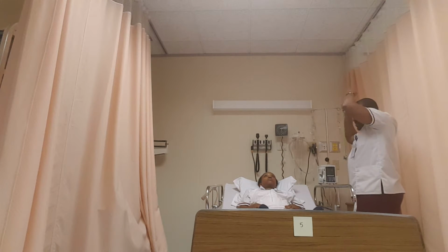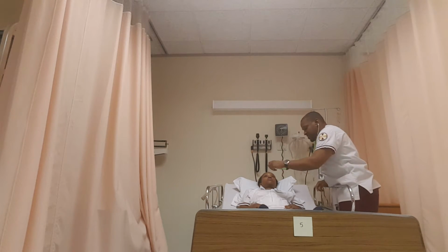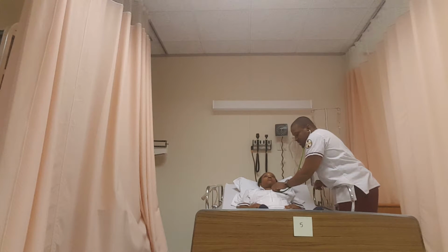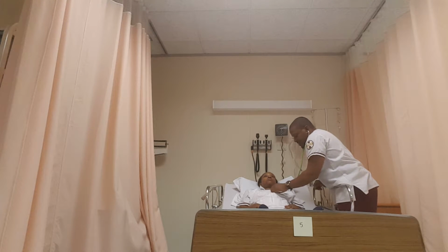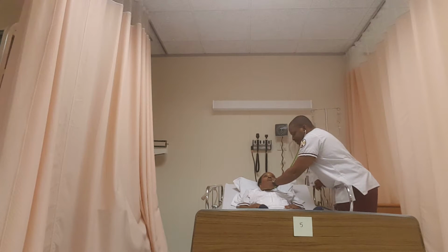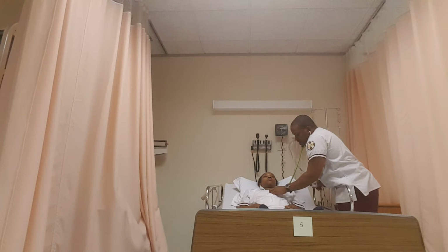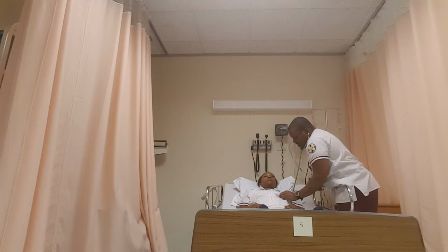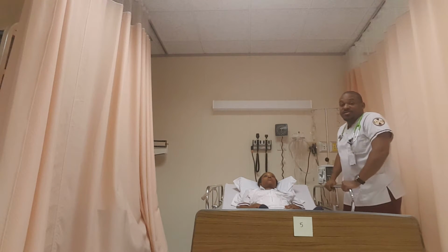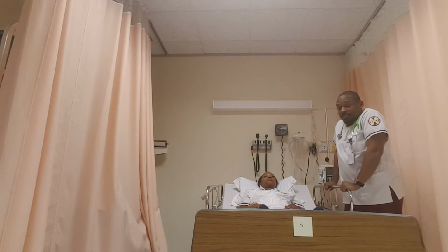Next, I'll listen to the heart sounds, both with the diaphragm and the bell. Start with the bell first, or the diaphragm first. Check the aortic, pulmonic, tricuspid, mitral, and check with the bell, aortic, pulmonic, tricuspid, mitral. Normal S1, S2 heart sounds noted, no abnormalities, no murmurs noted at this time for the patient.